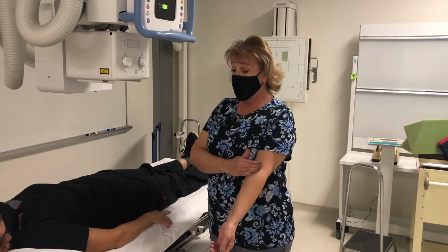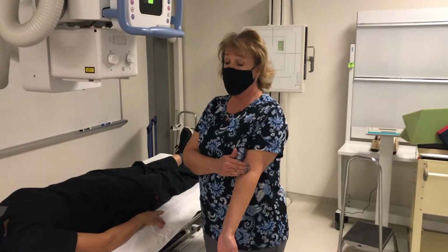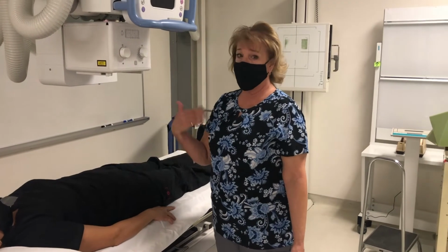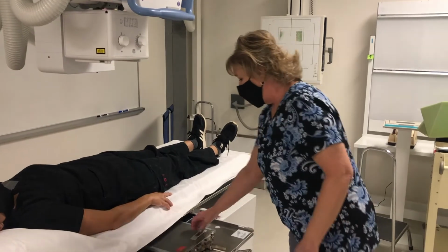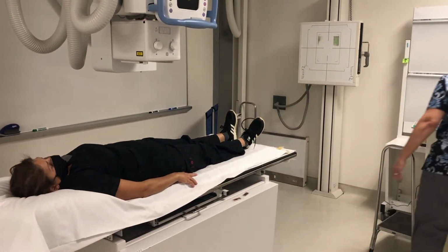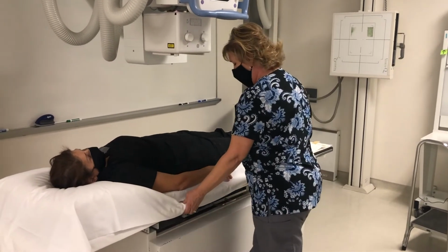So we leave the IV in their arm 5 to 10 minutes, because normally most contrast reactions, the severe ones, are gonna happen right away, and that way we still have venous access to administer drugs to counteract whatever problem they might be having. So she is fine. I've removed the needle from her arm and placed a bandage on it. Made sure that the bleeding has stopped.